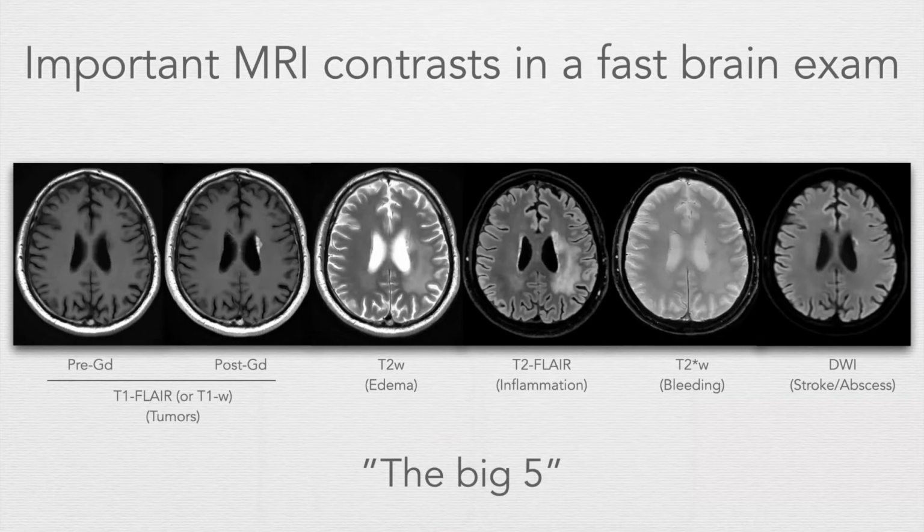For brain, this is now very different from how most research would view what they want to do. Many MRI researchers doing method development are interested in mapping techniques, maybe like fingerprinting. But in clinical care, where we work, the weighted contrasts are the workhorse for diagnosis.